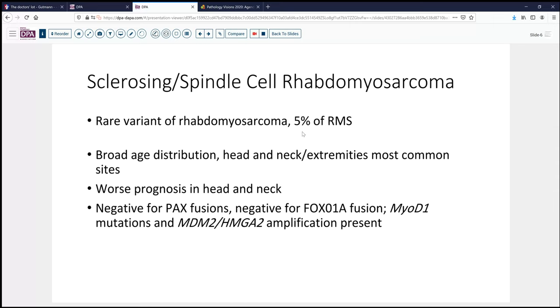Previously it was grouped with embryonal rhabdomyosarcomas, but it has been recognized as somewhat distinct due to its cytogenetics and morphology. Its characteristic morphology is a very hyalinized and corded pattern with dense sclerosing-type collagen, as seen in our slide. It occurs in a broad age distribution and a variety of locations — mostly head and neck, but also extremities, with adults more often seeing head and neck involvement and pediatric patients more often seeing it arise in the extremities. Prognosis is somewhat worse when it arises in the head and neck. It is negative for PAX and FOXO1 fusion genes, but will have MyoD1 mutation and MDM2/HMGA2 amplification.